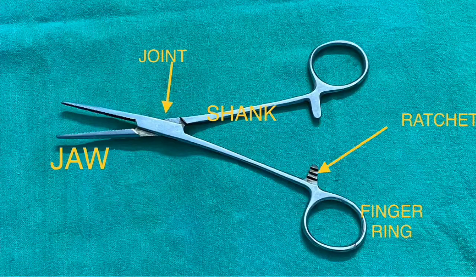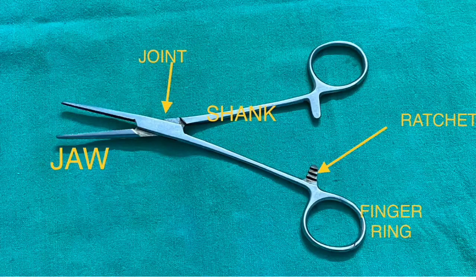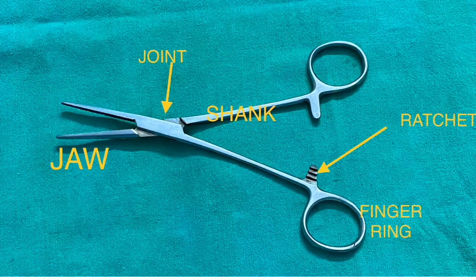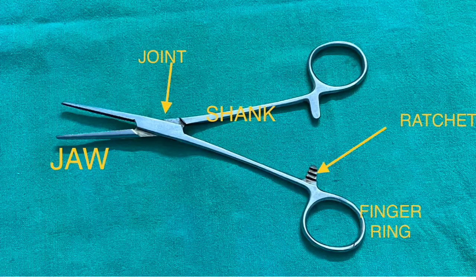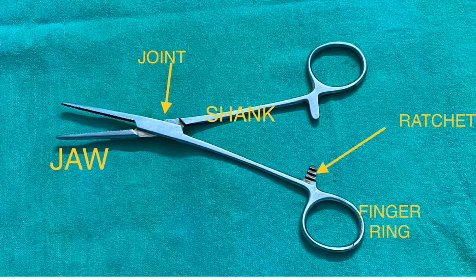One variant is the box joint — you can see a box kind of joint here. Another one is the screw type, where the two blades or two shafts are joined with a screw. The next part is the shank, which is the body of the instrument.